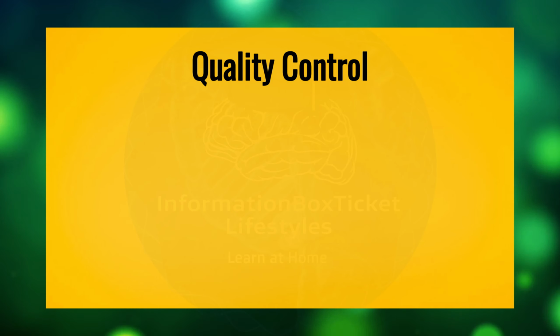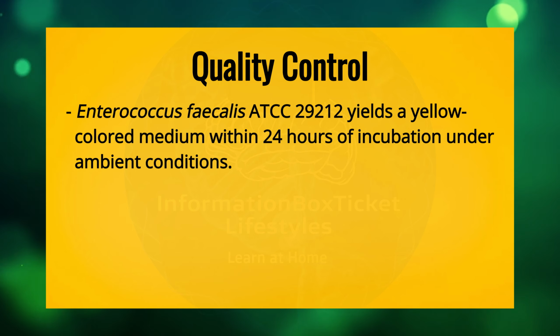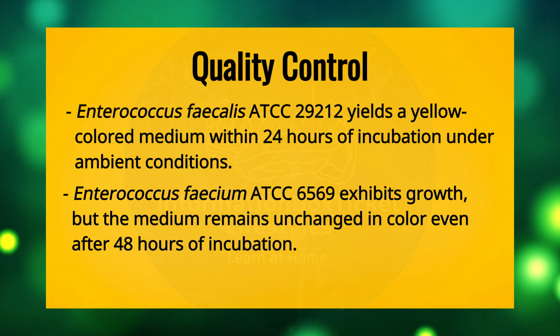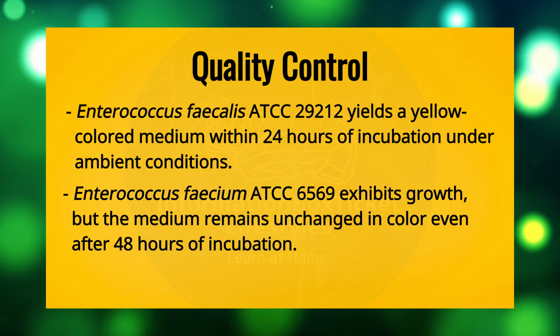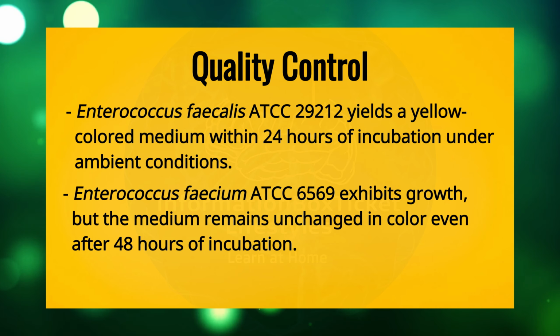Quality control. Enterococcus faecalis ATCC 29212 yields a yellow-colored medium within 24 hours of incubation under ambient conditions. Enterococcus faecium ATCC 6569 exhibits growth, but the medium remains unchanged in color even after 48 hours of incubation.